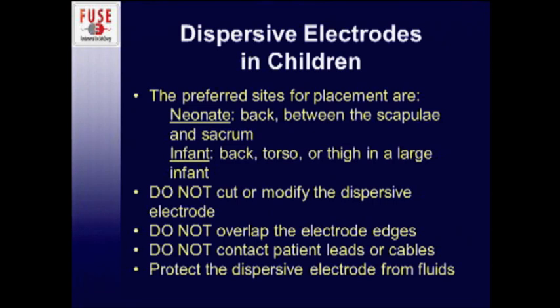And finally, you really need in children to be sure, in everybody, but especially in children, to protect that dispersive electrode from fluids. So in all of my patients, I will put waterproof drapes on the side and prep right down onto them. And this, not only in small children that have a large body surface area to volume, helps keep them warm if you have a warming device underneath, and it protects that dispersive electrode if it's on the back.